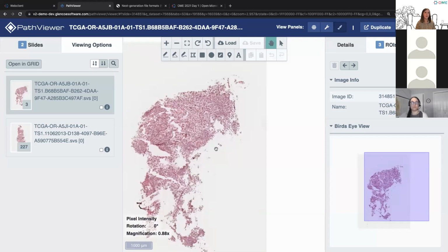So you have the original, full resolution array that could be quite large for some digital pathology data. This is easily 100K by 100K pixels. And so many file types that support this kind of data have a pyramid of resolutions, that original array downsampled any number of times to form a pyramid of smaller and larger arrays.